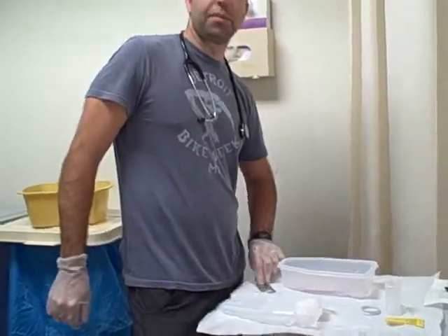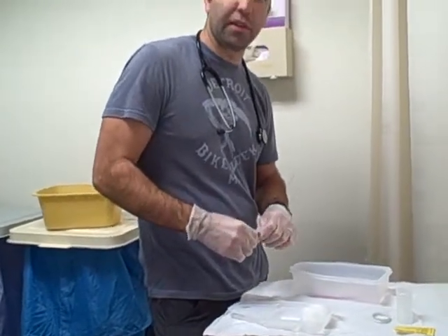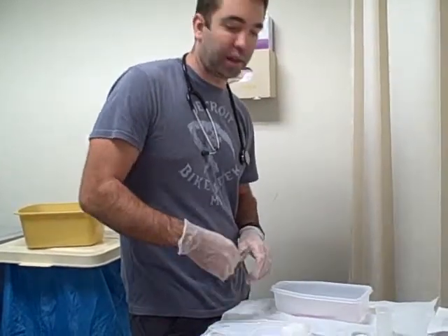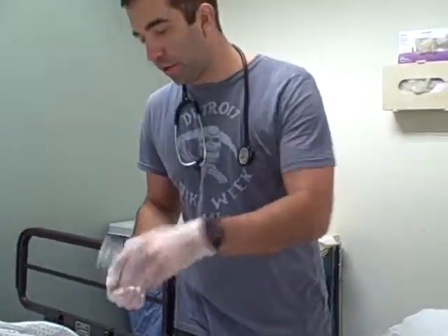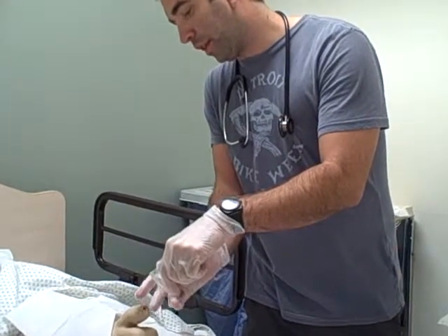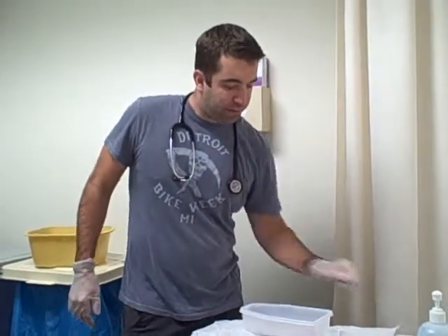So the next thing I want to do is lubricate the penis, and then I'm going to also put a little bit on the side here, so I can lubricate the tip of the catheter as well. You can use this little basin here if there was no lidocaine on it. And then in real life, I would also have a syringe that I could fill up with lubricant, and then lubricate inside the penis. Sometimes this also comes with lidocaine too, but we don't have either one of those. Alright, so I did that, lubrication.